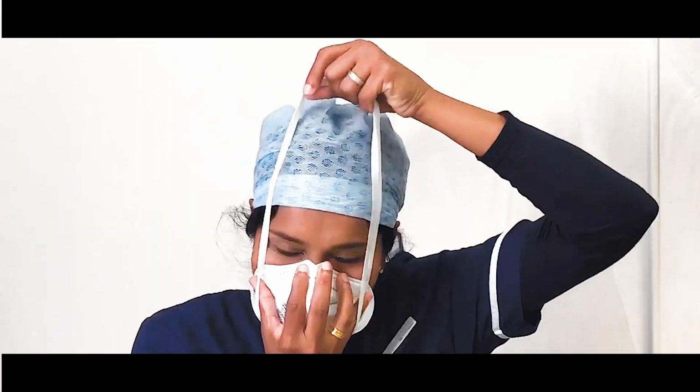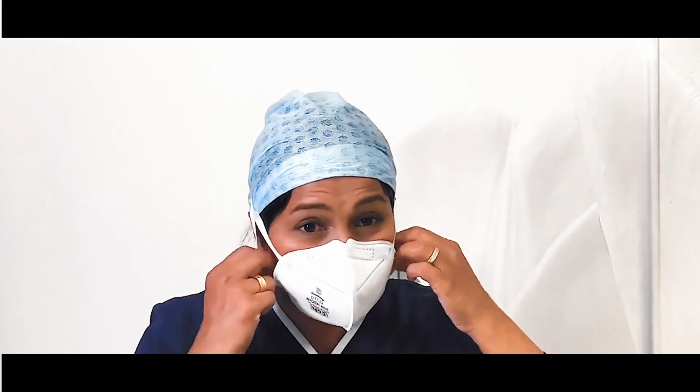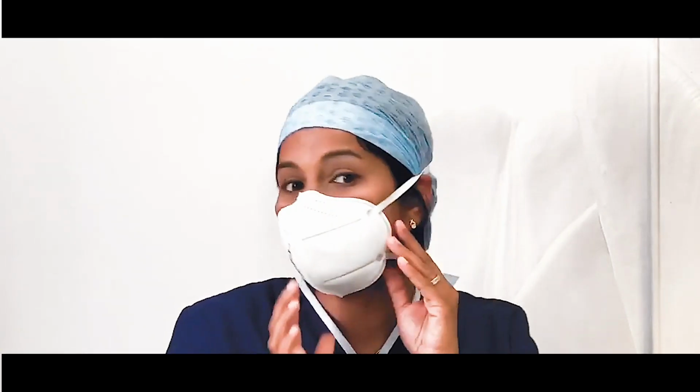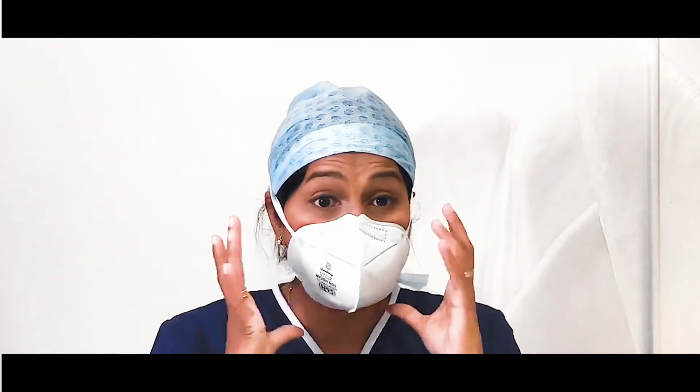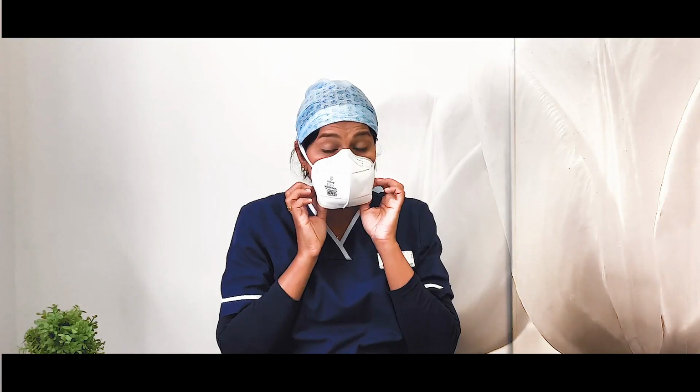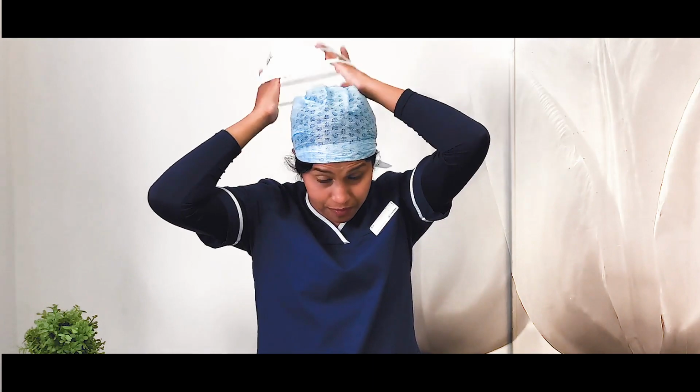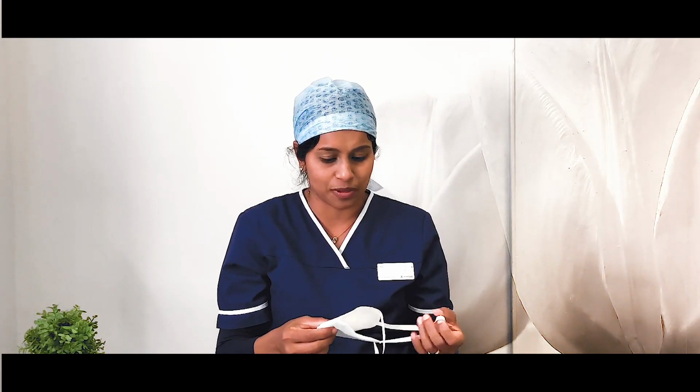These give you a bit better seal, and as you can see, the seal is quite good. It is quite comfortable. It again depends on the shape of the face and the person. I did not fit test on any of the N95 or FFP2s, unfortunately, but this is all that is needed for a lot of people depending on the size and shape of their face.